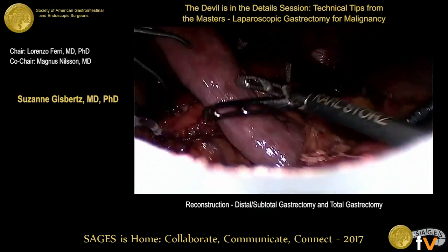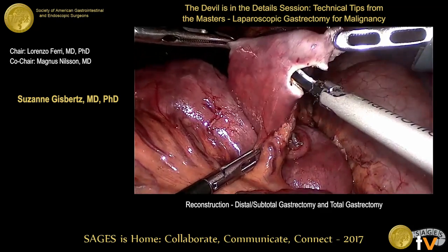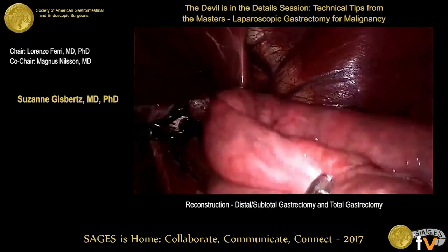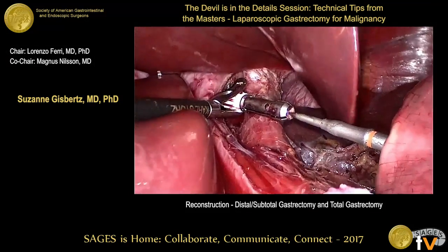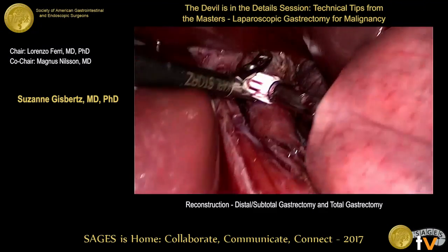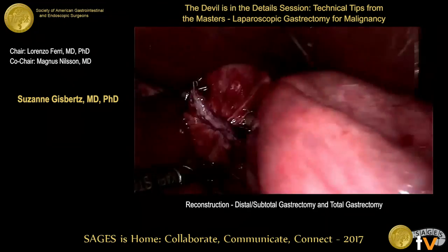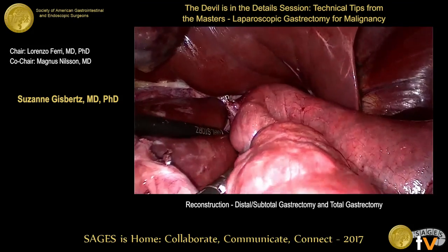Miguel explains: he prefers to pass the jejunal loop retrocolic. You open the loop of the jejunum, introduce laparoscopically the circular stapler, accomplish the connection, close the device, and fire it. Thereafter, you have to resect the lateral loop where the circular stapler was introduced.